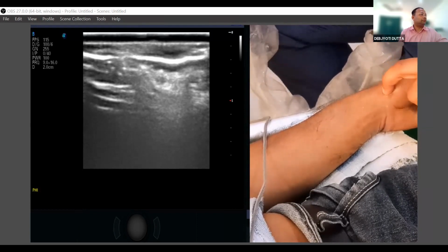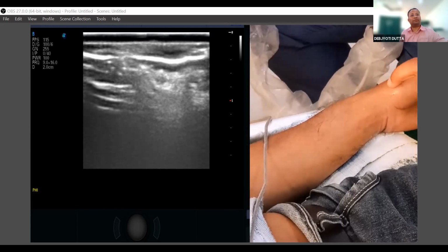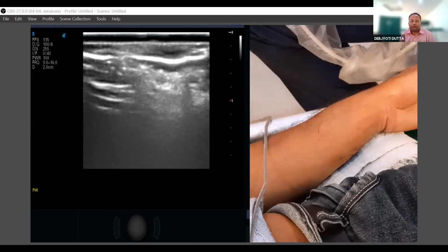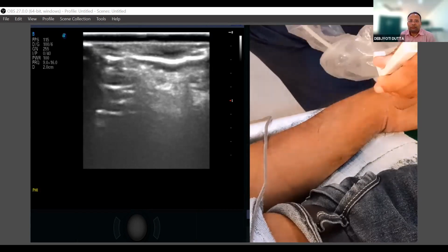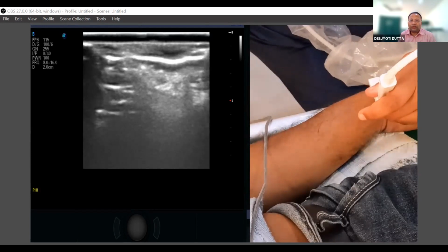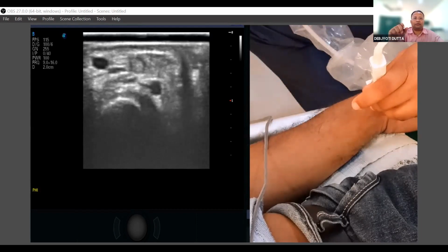This tendon you can see on this side. This is the abductor pollicis longus and this is the extensor pollicis brevis. So in this snuff box, this tendon is the extensor pollicis longus, this one is the extensor pollicis brevis, and this one is the abductor pollicis longus. So we are putting it over that. Again, the left portion of the screen is towards the dorsal surface.